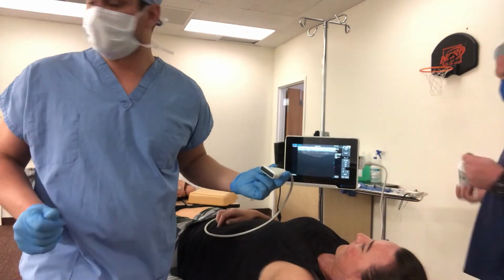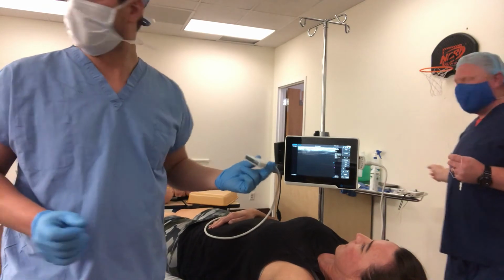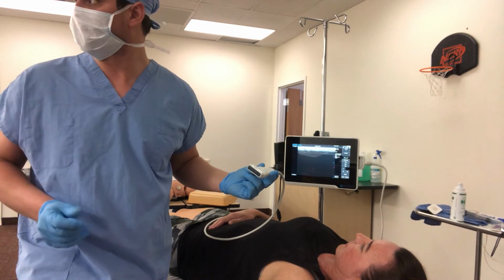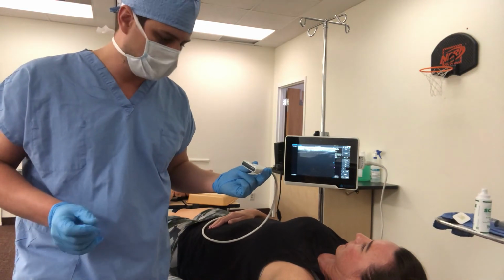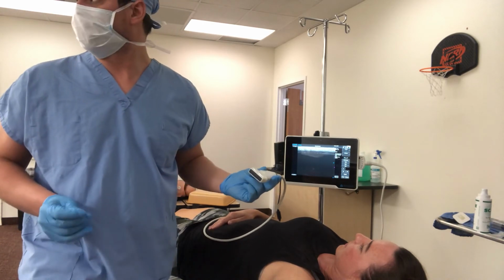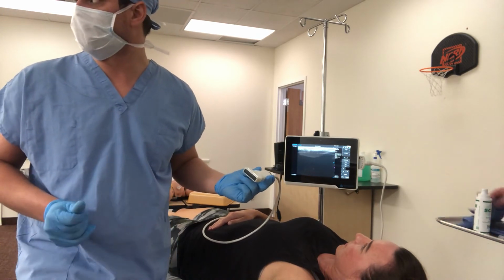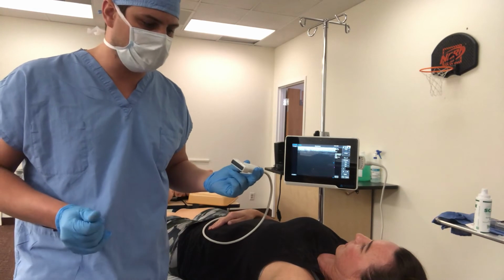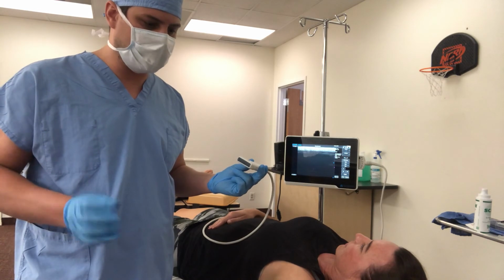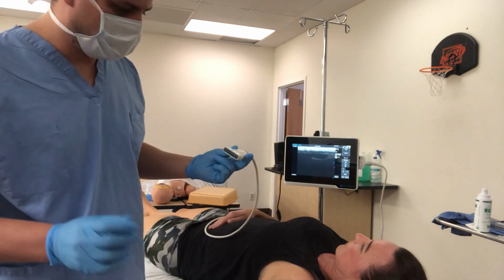And for this procedure, we have drawn up 0.5% bupivacaine, since we're going to do a surgical block. And I will give no more than about 20 to 25 milliliters. The max dose is 210 milligrams or 42 milliliters. And I'm going to inject about 6 to 7 milliliters per nerve.